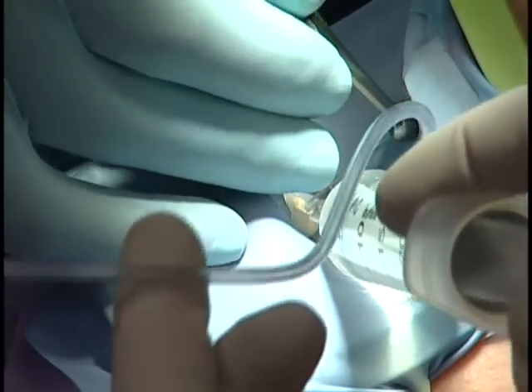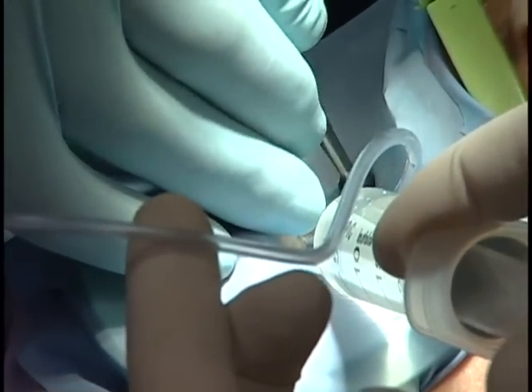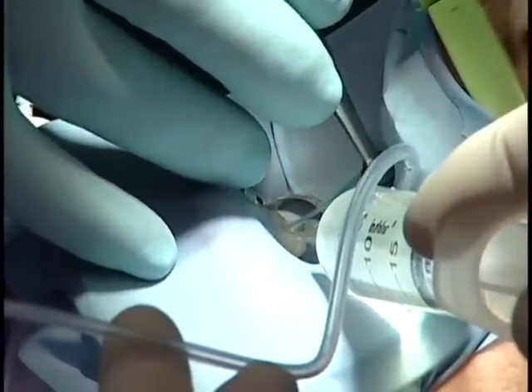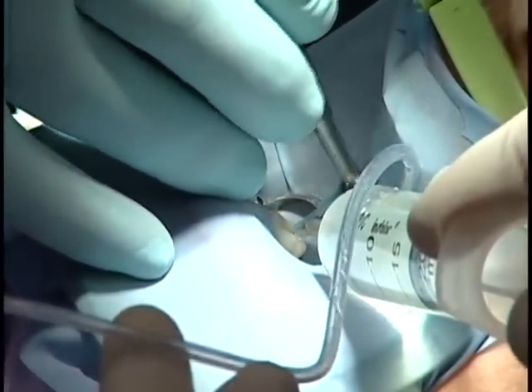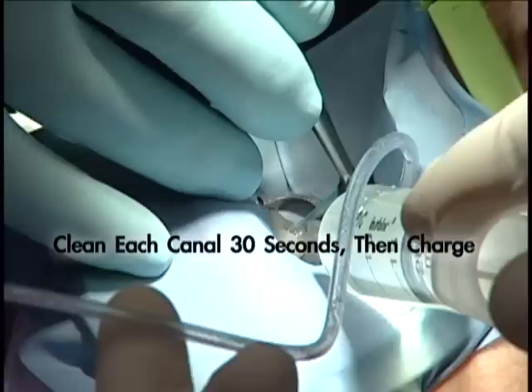After I clean each canal for about 30 seconds, I'm going to pull the macro cannula out quickly and say the word charge. This tells Jennifer that I'm going to pull the macro cannula out, and she should follow approximately 1 second later, removing the master delivery tip. This will leave the canal charged with fresh irrigant while I move to the other canals. When all canals have been cleaned and charged, I'll move on to the micro cannula and apical cleaning.